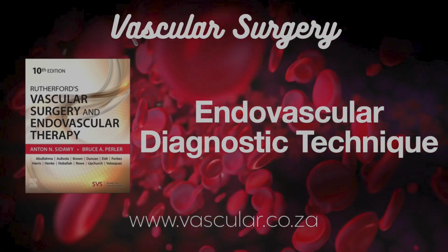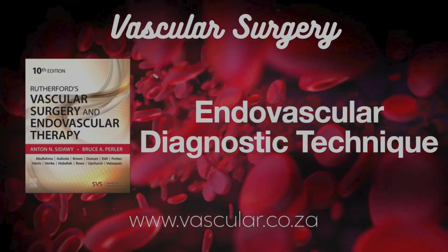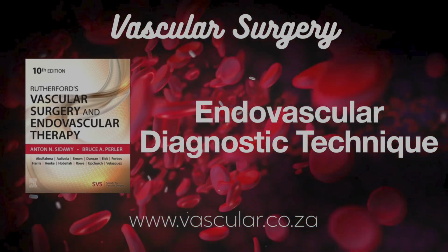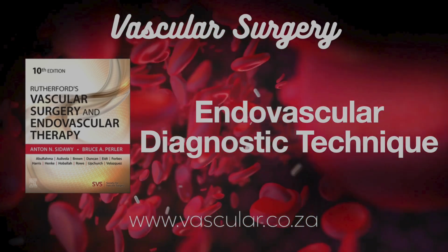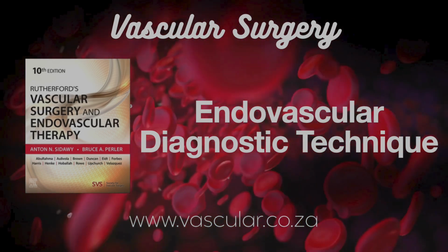You mentioned that briefly, going down instead of up. Right, antegrade means pointing the needle towards the foot. It's less common for just diagnosis, more for interventions further down the leg. When might you choose that? Maybe if someone has kissing iliac stents, which can make going up and over the bifurcation tricky from the other side. Antegrade keeps things in one plane, can give better push. But it sounds harder. It can be technically more demanding, yeah.